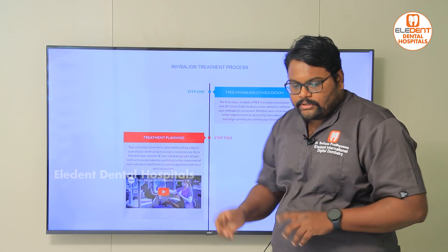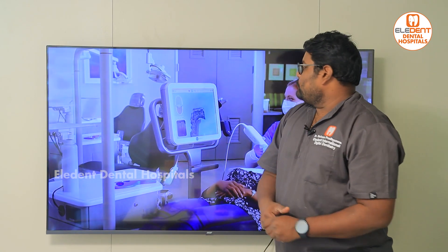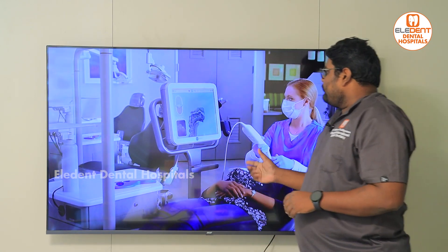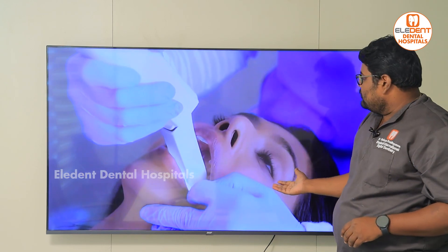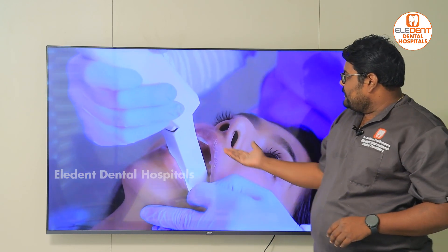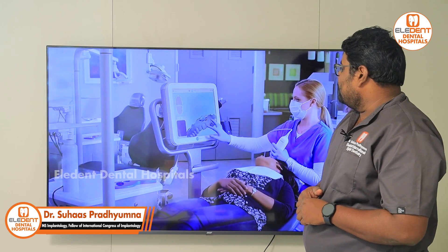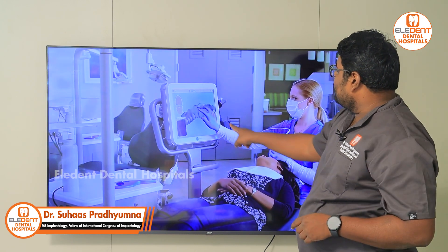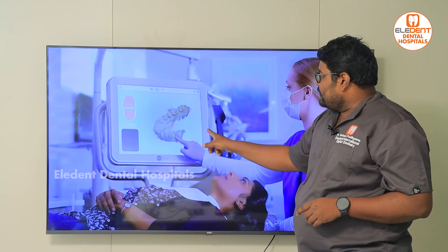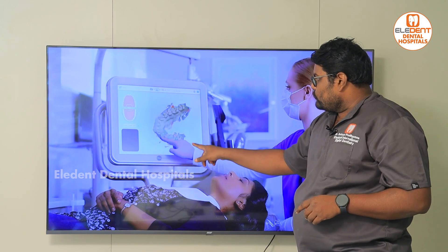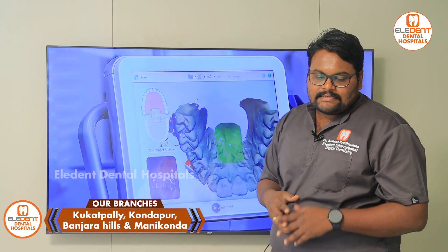You can see how this is done. We scan your teeth with the iTero scanner, which records all the measurements of your teeth and soft tissue, and this file is then sent to Invisalign.